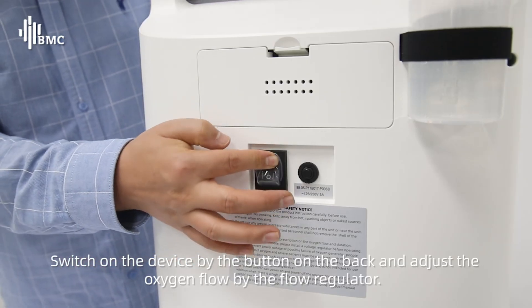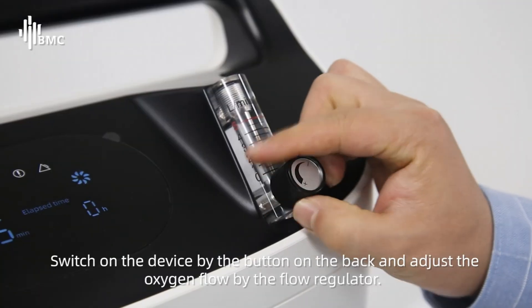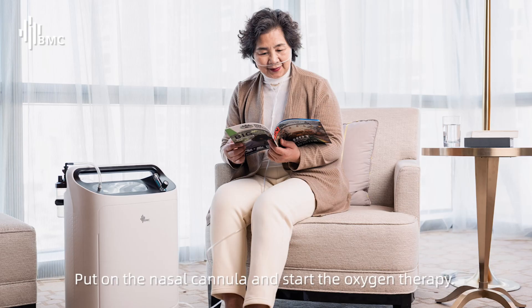Switch on the device by the button on the back and adjust the oxygen flow by the flow regulator. Put on the nasal cannula and start the oxygen therapy.